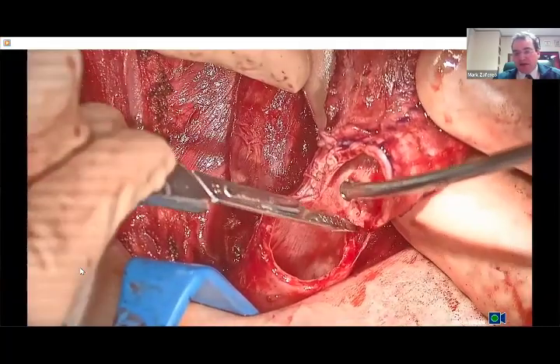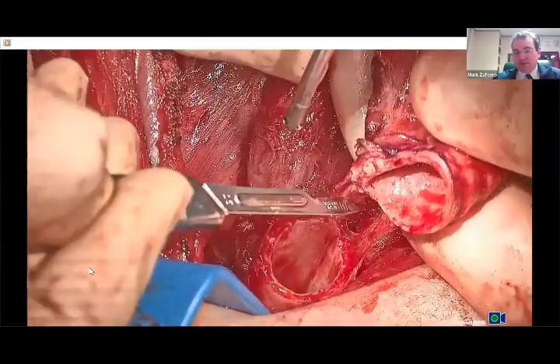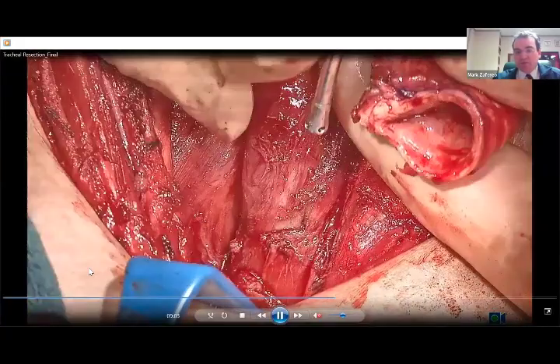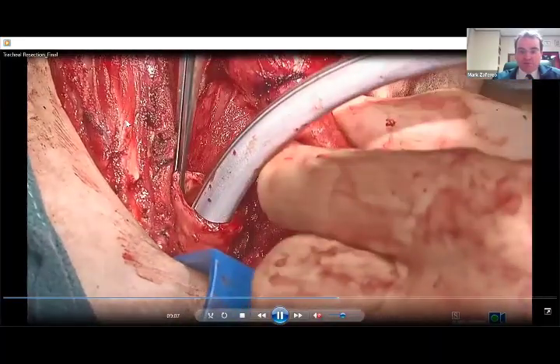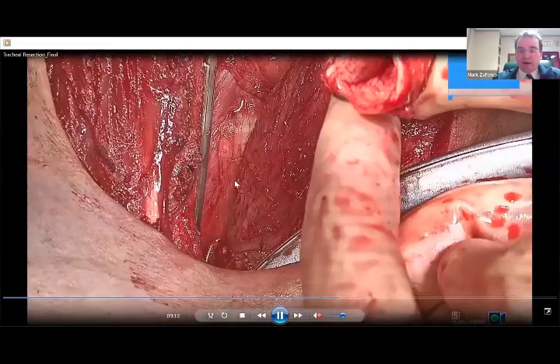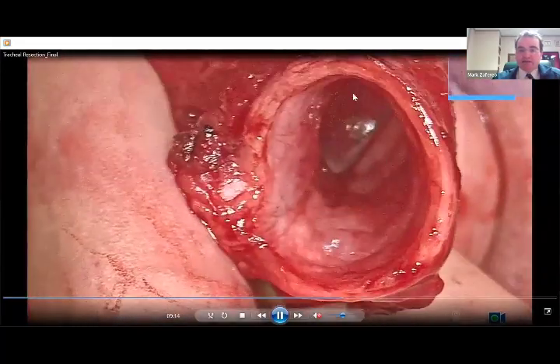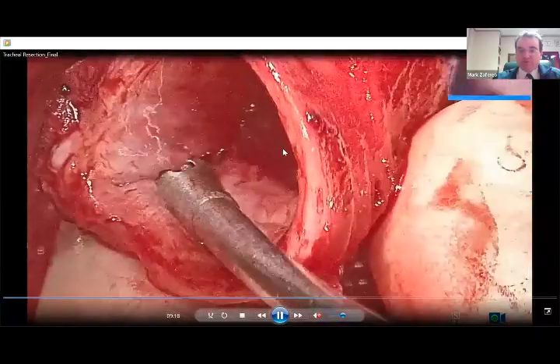And then you're beveling up as you come along the mucosa, if possible, to try to save as much of that mucosa as possible. So that's the inferior cut, and then you're intubating the patient with the wire reinforced tube. And then you can go back and look inside to see your margins and how much you need to take.